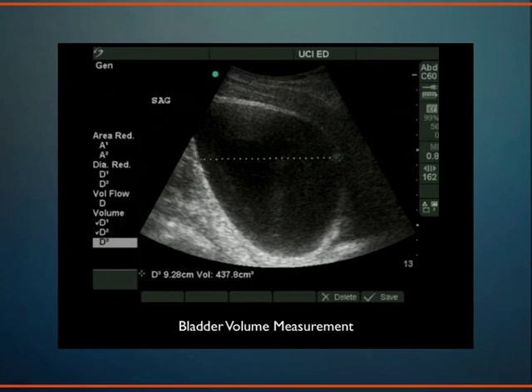Well, some of them just urinated in their diaper, and you would unnecessarily put them through the procedure of a bladder catheterization, which is painful. So you could avoid that unnecessarily; you have to wait until the bladder fills up, basically. So I train my nurses to do this, and they take a peek at the bladder before they bother putting a catheter into a small child.